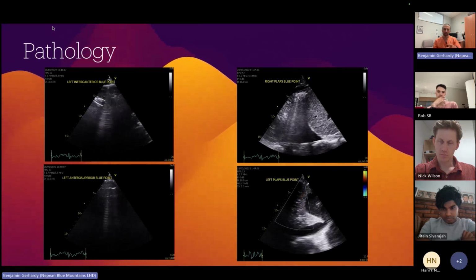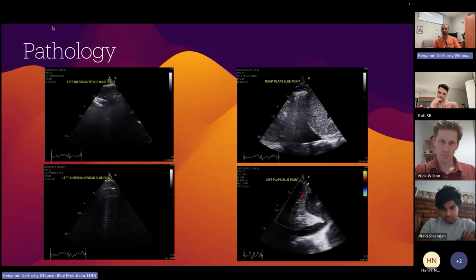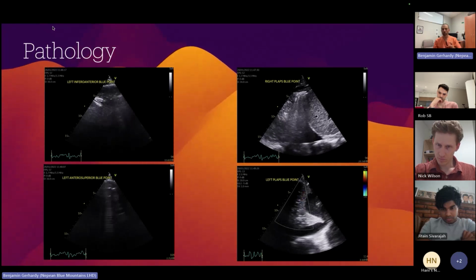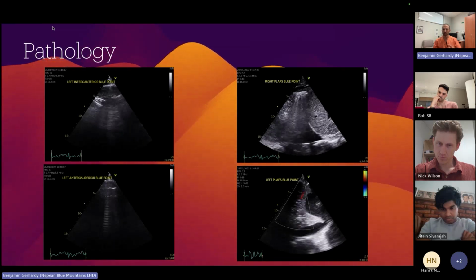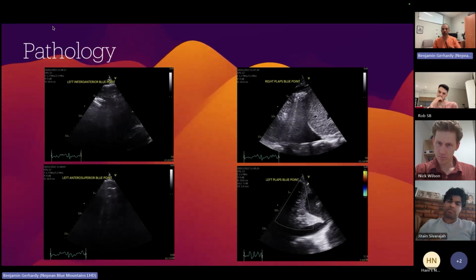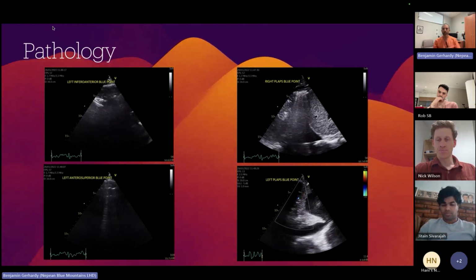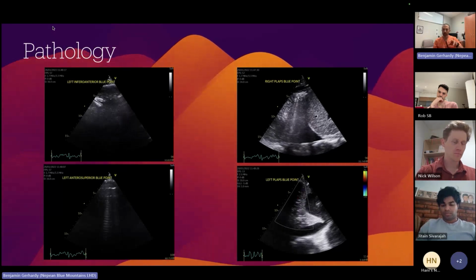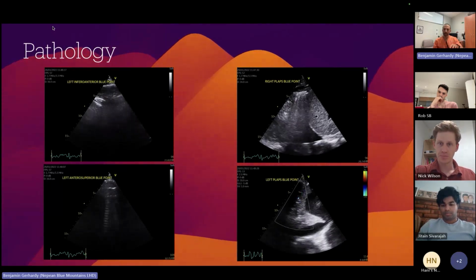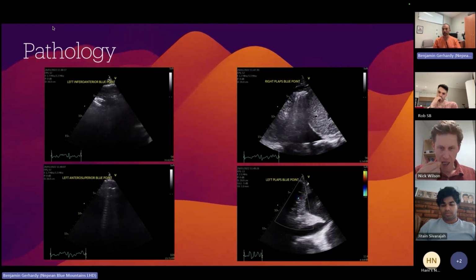And then the images on the right show some beautiful chunky consolidation. You can see some lung that is just barely, it's not ventilating, right? It's moving, but not getting bigger and smaller. In the bottom, they've put color Doppler on, showing some color going through those vessels there. So it's still got blood flowing through it, but it's just not being ventilated. And you can see off the top image on the right-hand side what looks like B lines coming off that chunk of lung, but they're not coming from the pleural surface. They're coming from air within that bit of lung. So there's still a bit of air in there. You just can't get the air out because you can't ventilate the patient, in that part of the lung anyway.